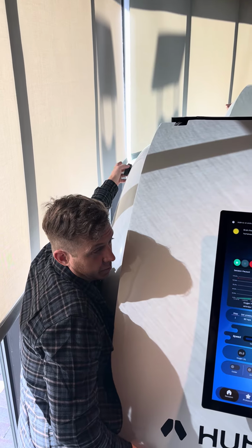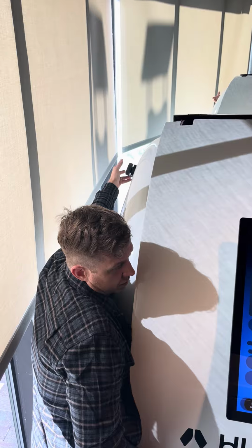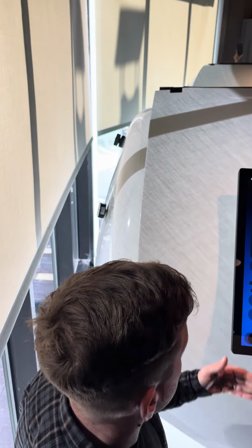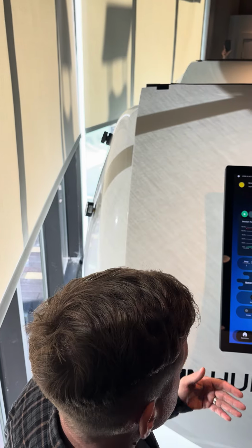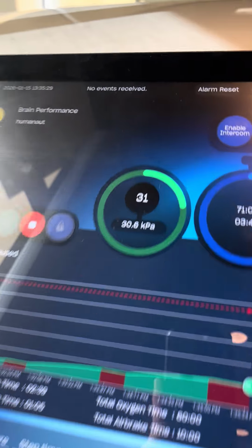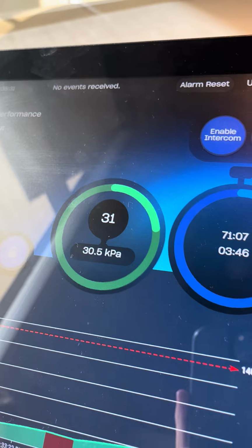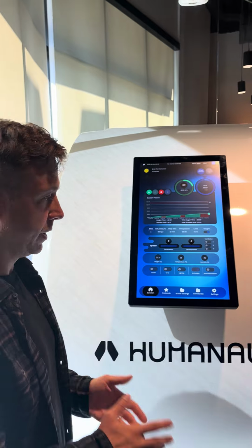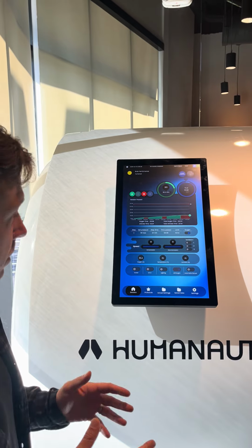You can hear it right away, but kind of like that. And then you're here. You're watching this, you have the timer. And you just decompress them nice and slow. You'll be out of the chamber shortly. We're going to decompress you at a safe speed.